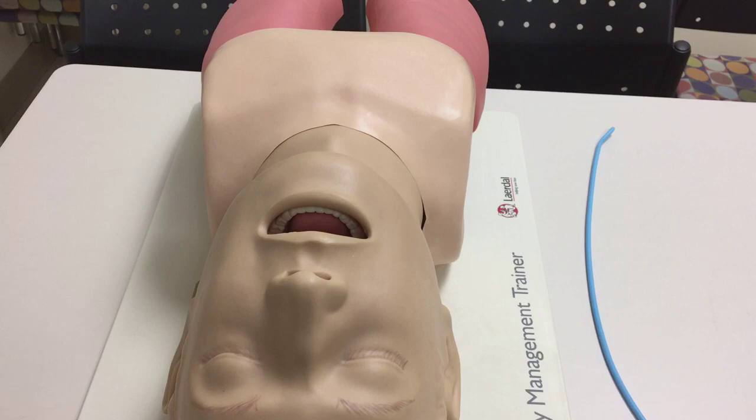This is an advanced airway demonstration. We're using a Mac 4 on a Lairdall advanced airway trainer. This is demonstrating your basic 7.5, getting a good clear view of the cords, and the technique behind it.